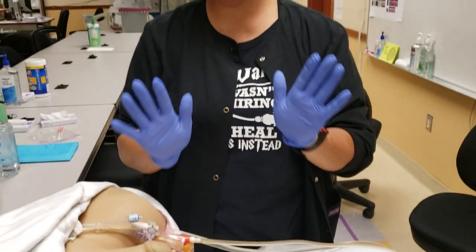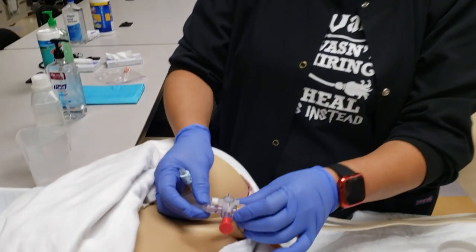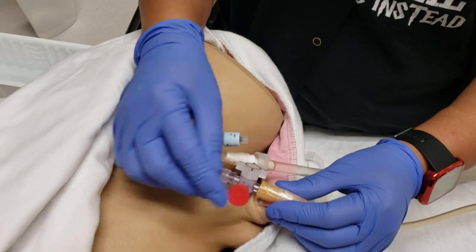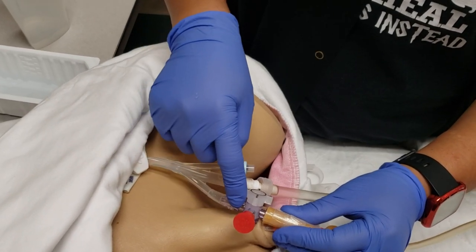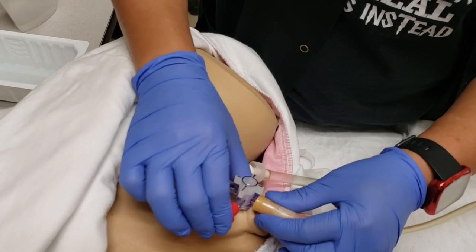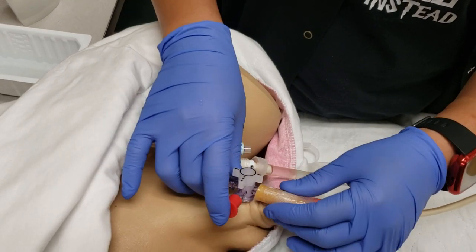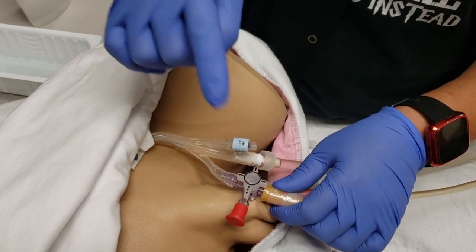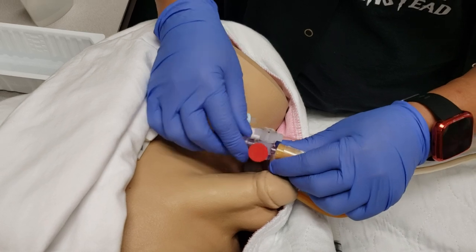There is a nicer option called the three-way valve, also known as the Lopez valve. It has three ports: one goes to the catheter, one to the outflow drainage bag, and one open access port for the syringe. This is preferable because it prevents you from repeatedly connecting and disconnecting the catheter, which reduces the risk of urinary tract infection.